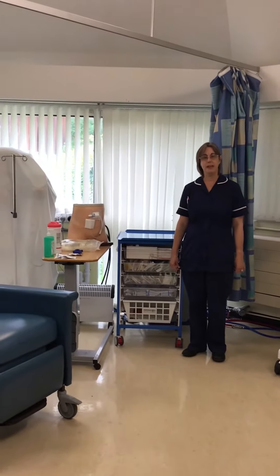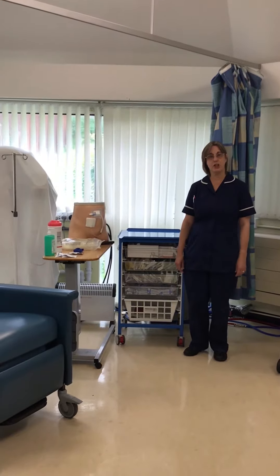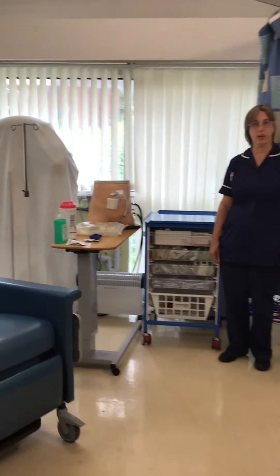Hello, I'm Sally, one of the PD sisters who works in home dialysis, and I'm going to demonstrate to you today how to do a solo dialysis exchange.